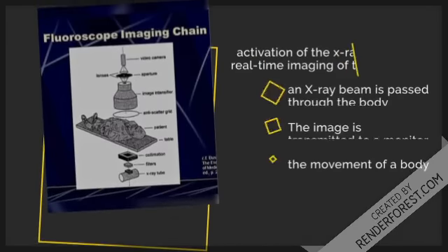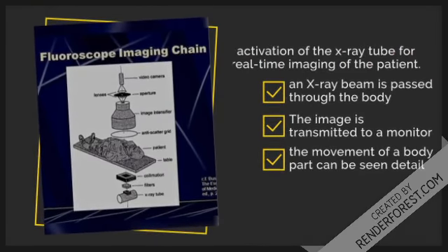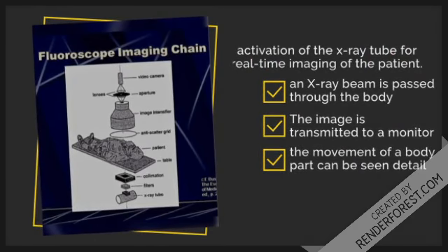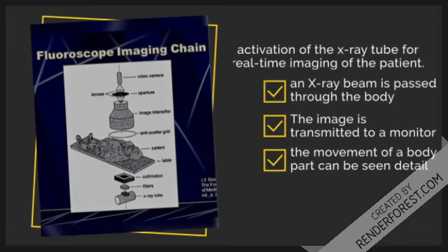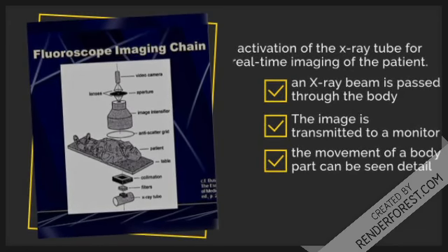Let's talk a bit more about X-ray here. So basically X-ray is an electromagnetic radiation that can be used to take images of the human body. Radiologists use barium to check the functions of the stomach, the small and the large intestines, colon, and rectum.